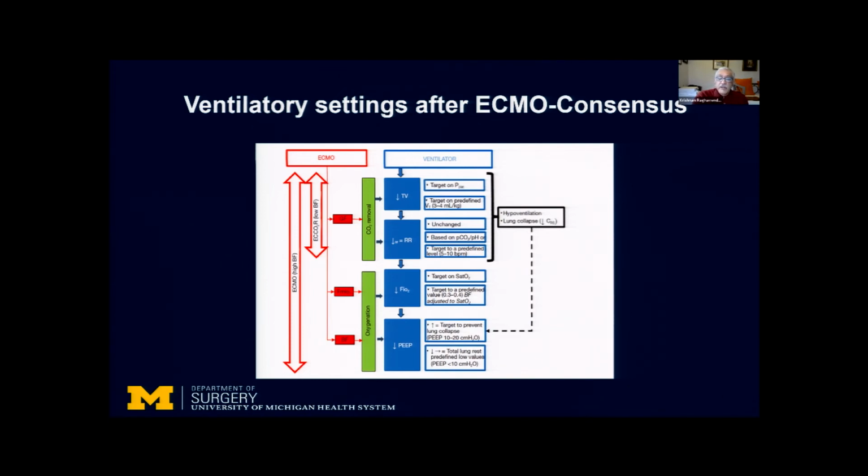So what we are trying to do is mitigate the amount of ventilator-induced lung injury by reducing the amount of pressure and volume on a small area of lung that is not affected by ARDS. We are also cognizant about PEEP. We are totally comfortable increasing the PEEP, but the target of PEEP is not oxygenation. It is more the mechanics of the lung. Remember, a lung that is inflated has the best mechanics. The lung that is deflated and collapsed has some very poor mechanics. And as you know very well, with ECMO, we can tolerate very low saturations. Our typical target for saturations following ECMO initiation is between 86 and 88%.